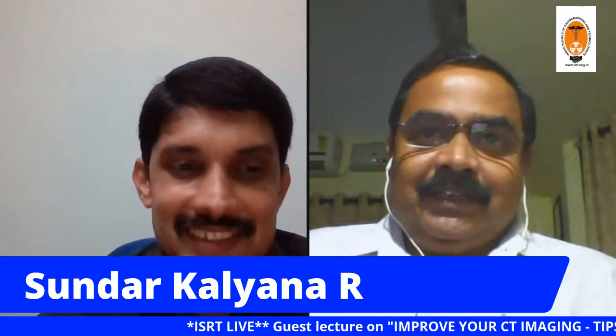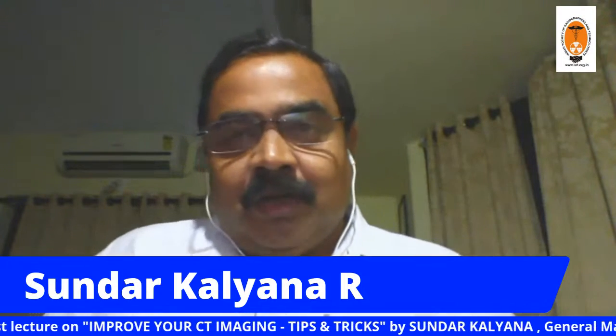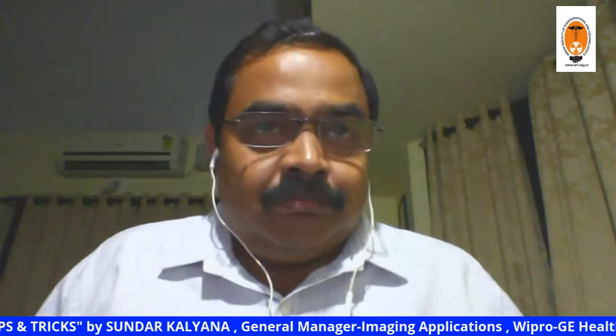In pediatric temporal bone imaging, how to reduce the dose? Very nice question, Rajesh. We should use the lowest possible dose. I know you are a user of the Revolution Evo scanner, where we have set it with slightly higher kV. I used 120 kV, because when you say pediatric, it's not really very small babies.